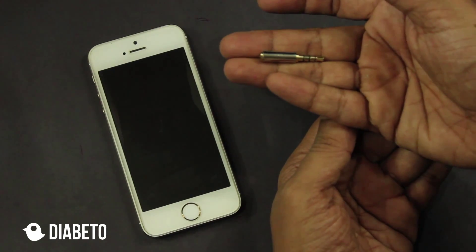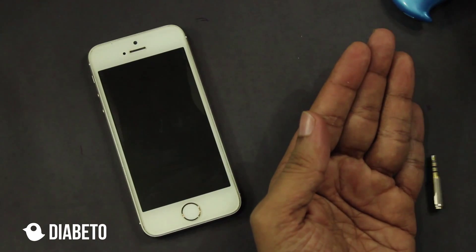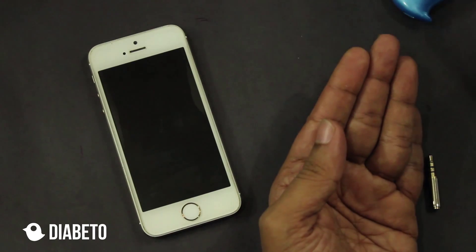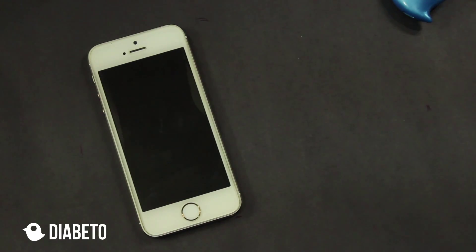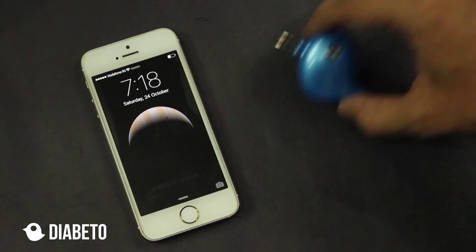This adapter is for using your Diabeto hardware with glucometers such as OneTouch Ultra Easy, which have a 3.5mm jack. Now without wasting much time, let's go and start the iOS application.